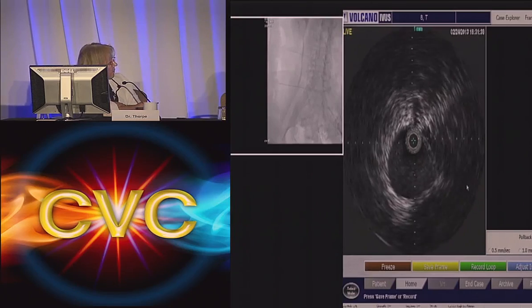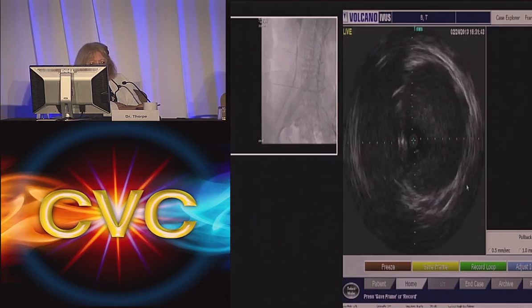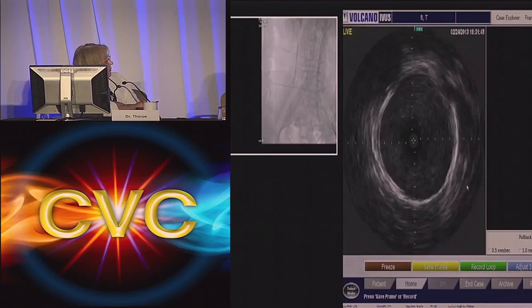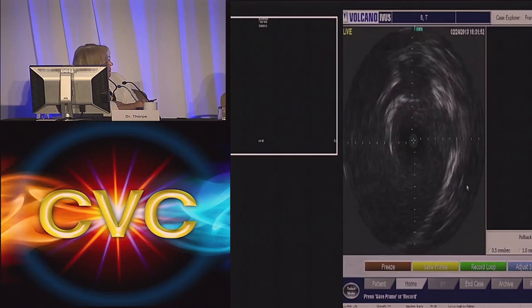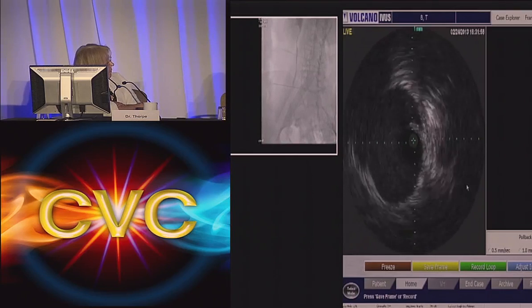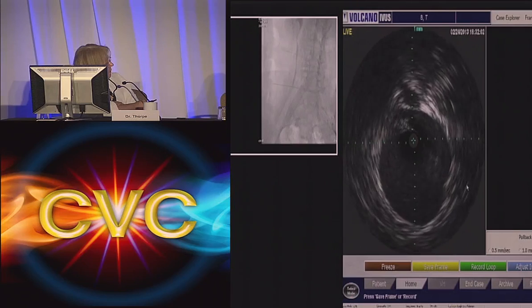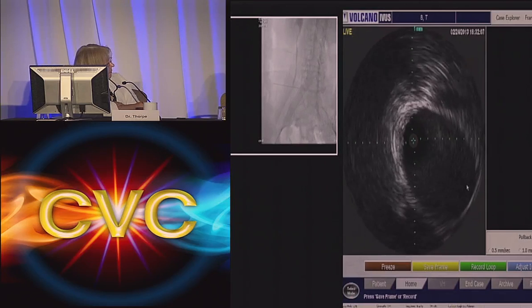And once we get to the common femoral external iliac, you see some webbing, which is actually residual unresolved old thrombus. Right there, see that? There's like a web effect in the vein from an old, unresolved, or completely resolved thrombus. And this is external iliac there. See another area where there's a little bit of webbing or synechiae, but not obstructing flow, to my estimation.